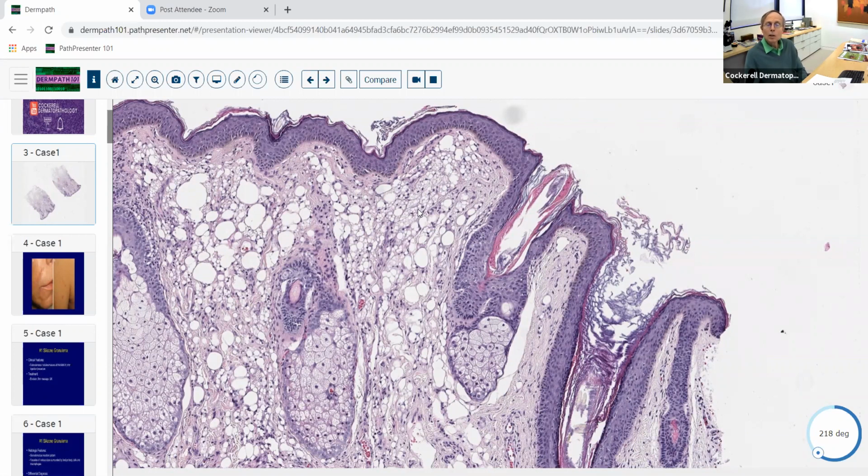You can also get clear discoloration from other types of material inside cells, like, for example, a renal cell carcinoma. That's clear, probably because of lysosomes and things like that in the cytoplasm of the neoplastic renal cells. Maybe some glycogen in there too, but it's not lipid. And then you can get clear discoloration because of the balloon cell change of a melanocyte, for example. So a lot of different things give you clear cells in the skin, and you really need to have a differential diagnosis of that.